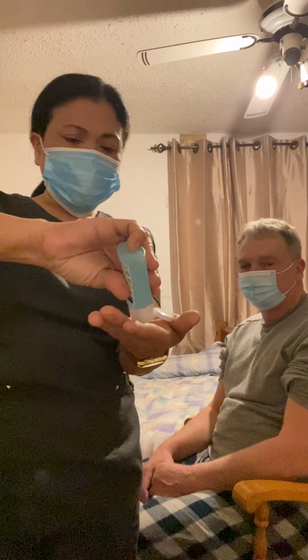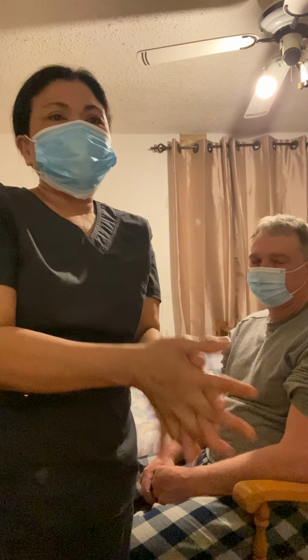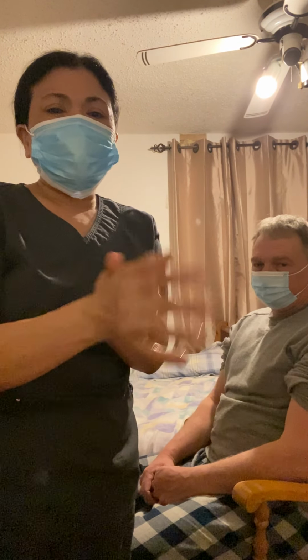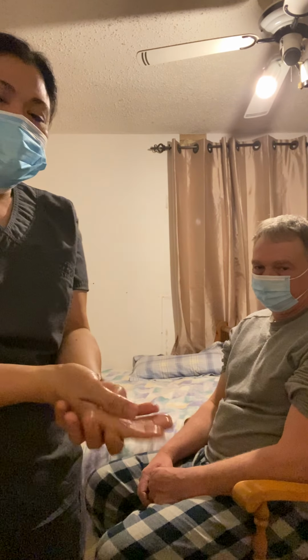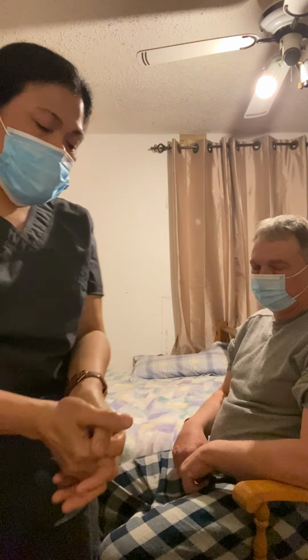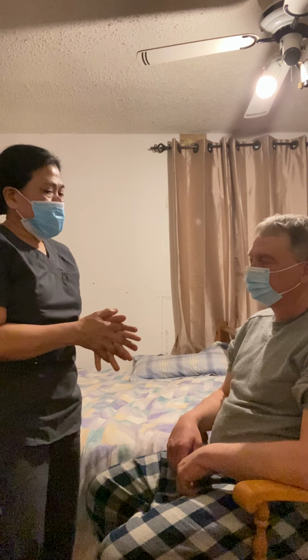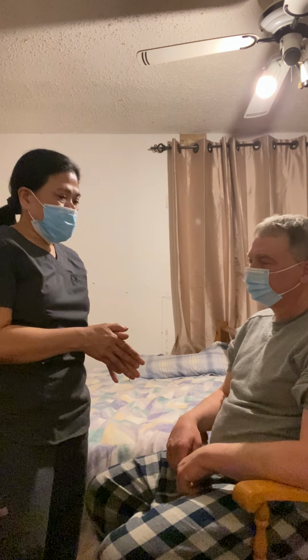So I arrive at the patient's room and I perform hand hygiene. I already washed my hands, so I just use the hand sanitizer. And then I'm going to introduce myself and ask permission from the client for what I'm getting ready to do. Well, hello, my name is Luzelle Shetler. I am an occupational therapy assistant student. So today I'm going to perform vital signs. Is that okay with you?